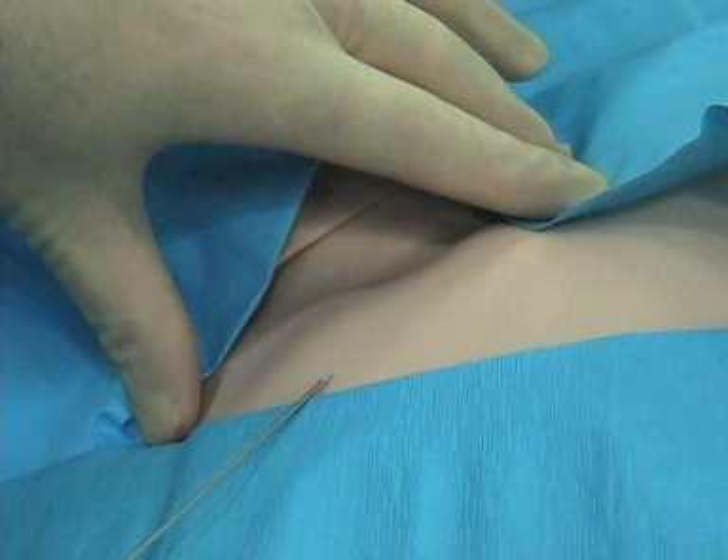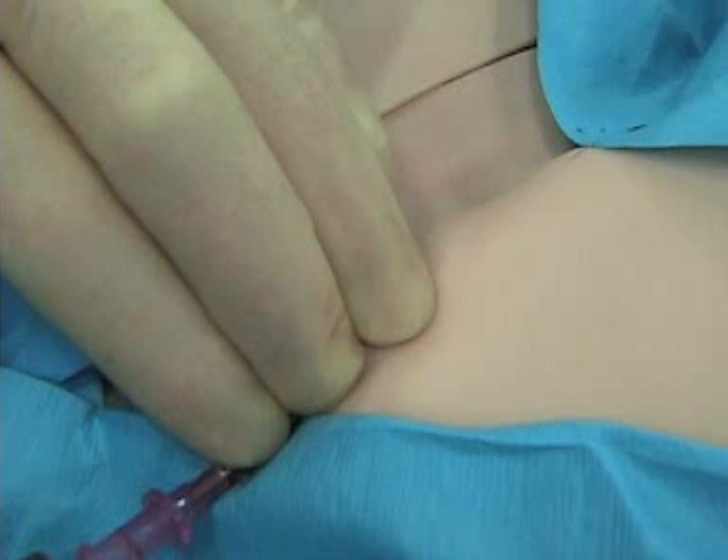You use the hollow needle. Don't bother using a finder here. You go in. Notice how my three fingers are pushing the needle down, keeping it parallel to the clavicle, not diving down. The three fingers push the needle down — keep it flat. That's a very important idea.